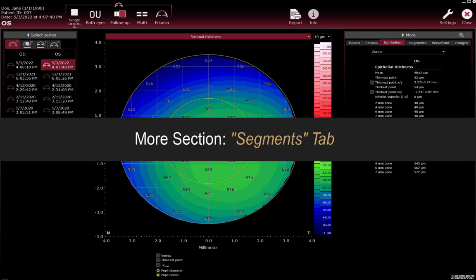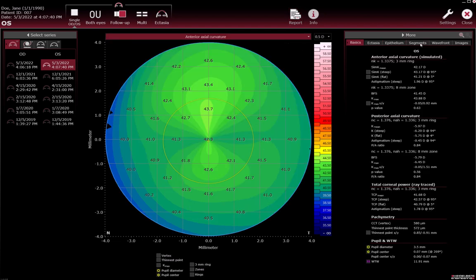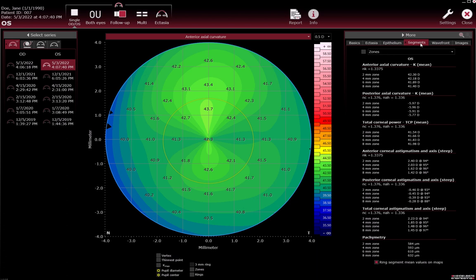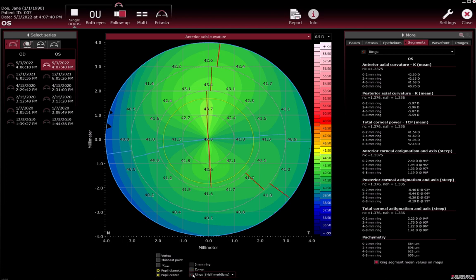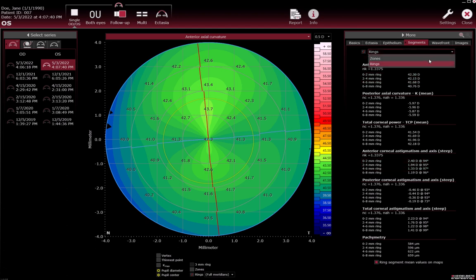More section Segments tab. To display the rings or zones on the colour map, check the checkbox next to the drop-down list or at the bottom of the map. Find the values in the Segments tab. Select half meridians or full meridians for the overlay. Alternatively, open the drop-down list and select whether the values and overlays should be displayed for rings or zones.